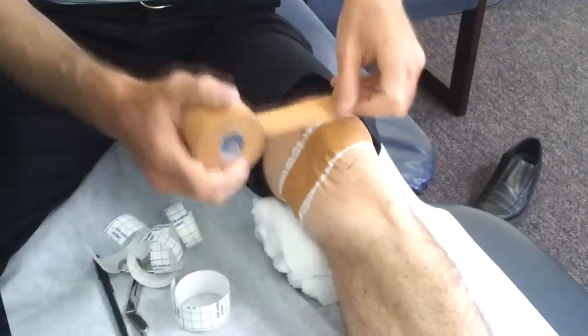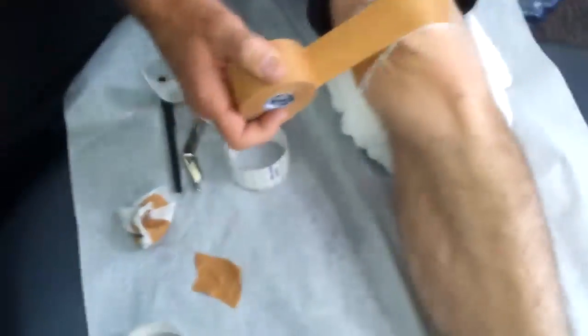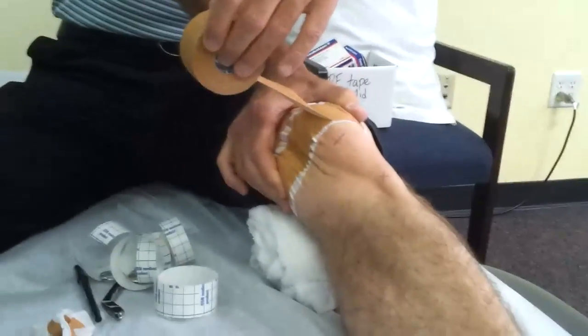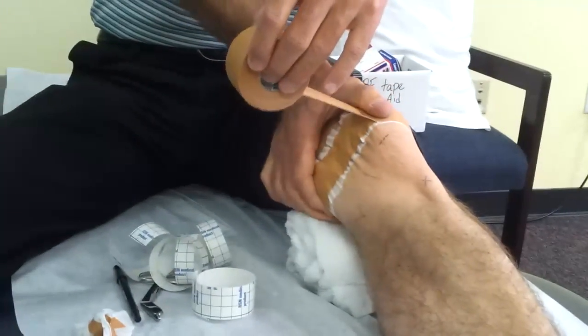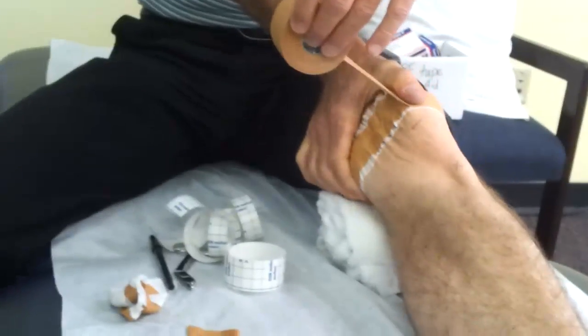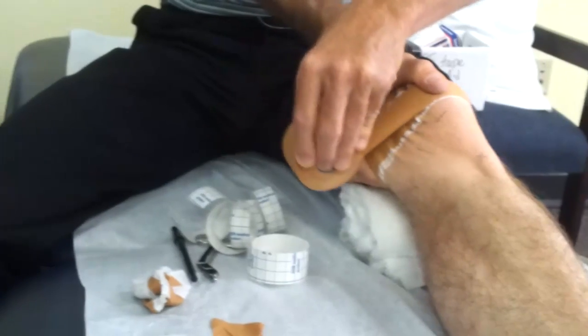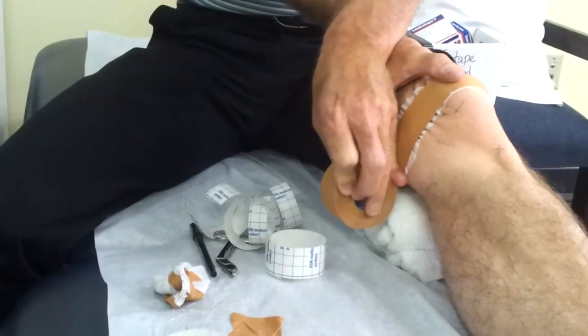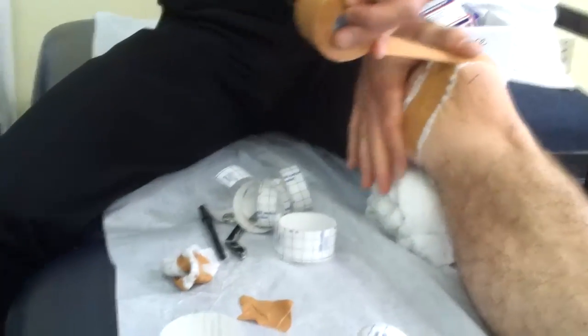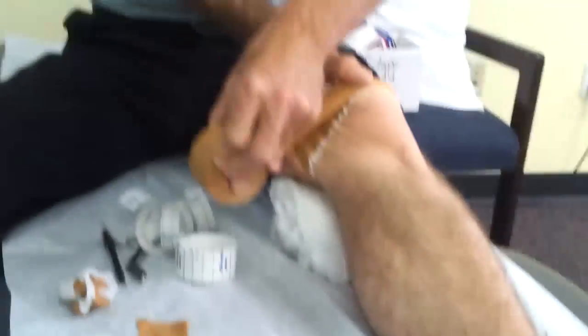Usually we do one medial glide and one of these. This second strip goes on top. Notice how I'm pushing it to get it to stick down. I push down with my thumb — this time on top of the tape — trying to push the inside part of the patella down. I've created creases in the brown tape. I lay that down without letting my finger off, because if I let off first and then lay it down, I get no creases.